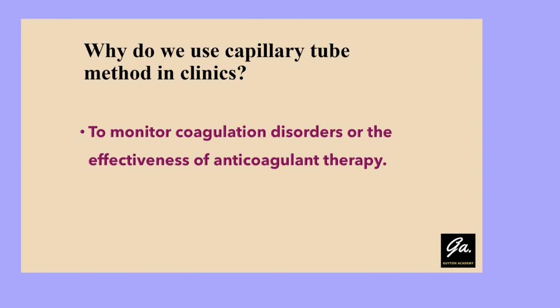Why do we use capillary tube method in clinics? Because to monitor the coagulation disorders or the effectiveness of anticoagulant therapy, to check if the anticoagulants are working in the human body or not working, so we can change different medications.